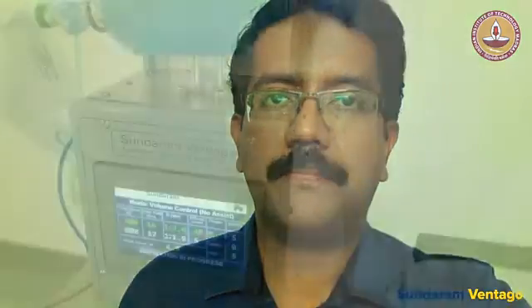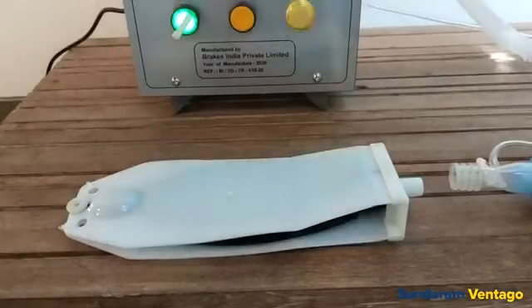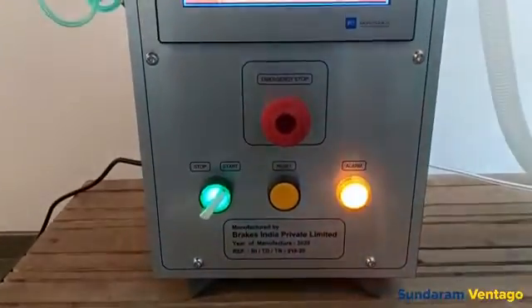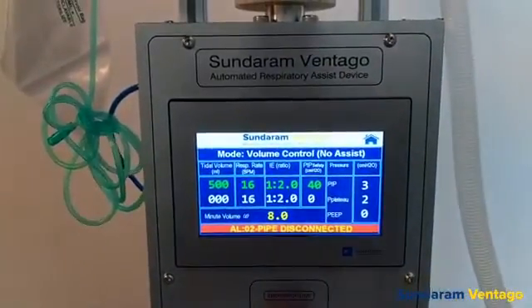We have performed a very detailed risk analysis and are working towards the product certification. To ensure patient safety, the device also has several built-in checks and alarms. For example, in the case that there is a leak or disconnection in the airway circuit, an alarm is triggered to enable clinical intervention as soon as possible.